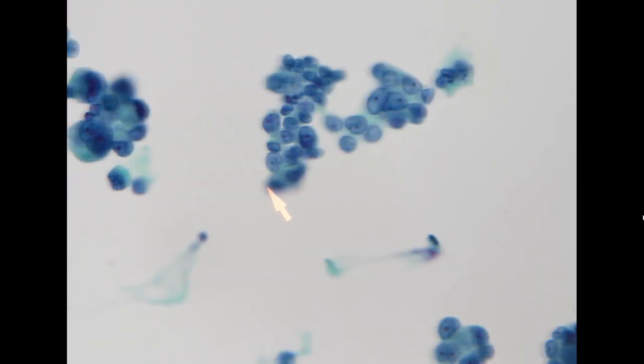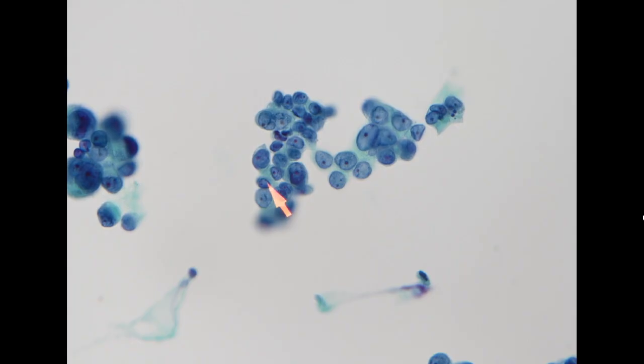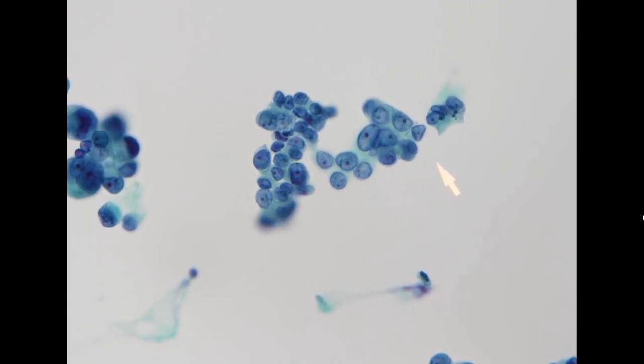So what we do here, whenever we see these specimens, is we would have a cell block preparation. And because this is the very first specimen, we will check if the tumor cells are positive for TTF1, which suggests that it is coming from the lung. This is lung primary.